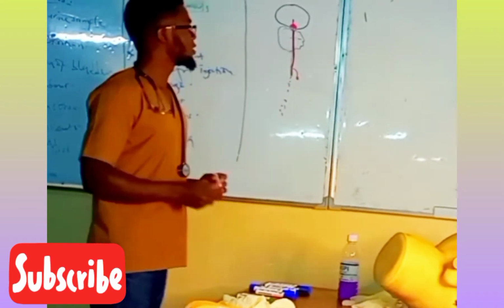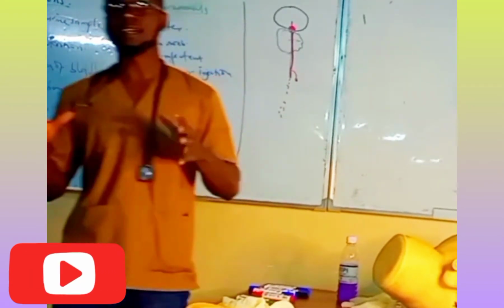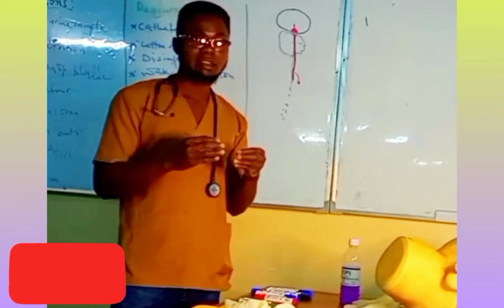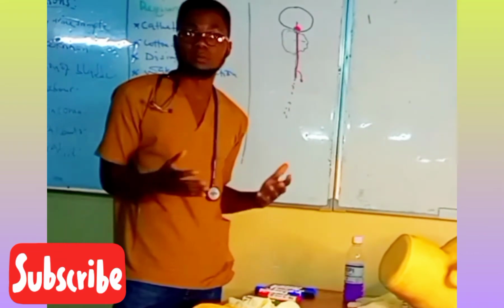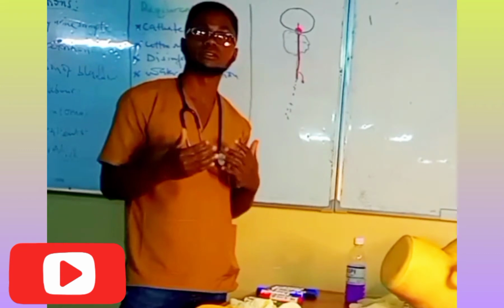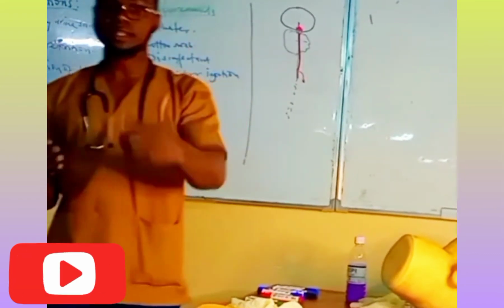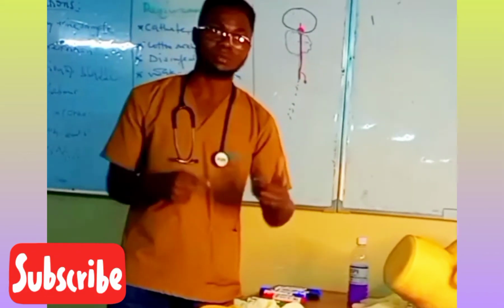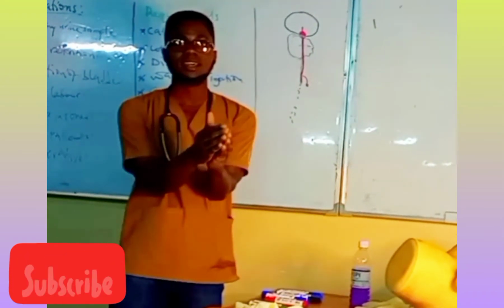Normally these patients with this enlarged prostate gland, we give them drugs which are going to bring this prostate gland to normal size. But the drugs are not going to work in 2 days. So it can be after months. So if the condition is prolonged from 1 month to 2 months, normally we change this catheter in the interval of a month. After a month, the patient comes, you change the catheter, they go back. After a month, they come, you change the catheter, until the prostate goes back to normal size and the patient can urinate.